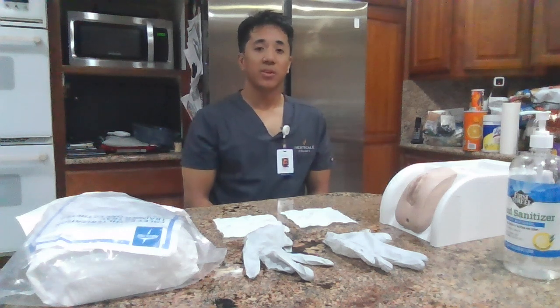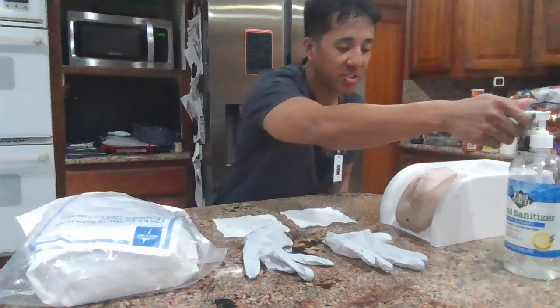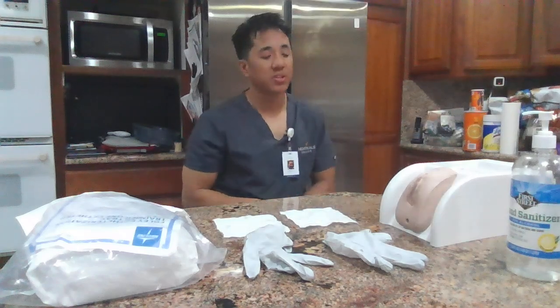Hello, my name is Julius Gavino, and today I'll be doing the female Foley catheter insertion. As soon as I enter my patient's room, I'm going to close the door and the curtains to ensure my patient's privacy. I'm going to perform hand hygiene, and then I'm going to introduce myself to the patient.